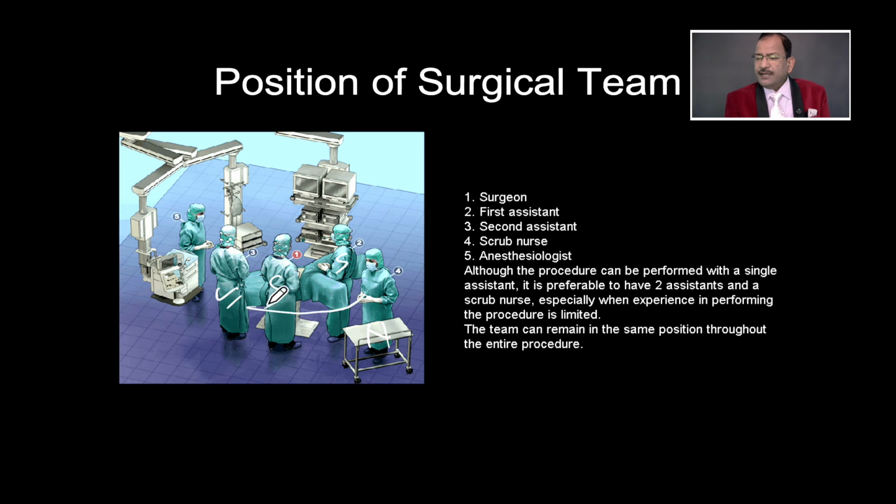Scrub nurse will be here to give the instruments to both the first surgeon as well as the second surgeon. And this is how you will position the patient and surgical team.